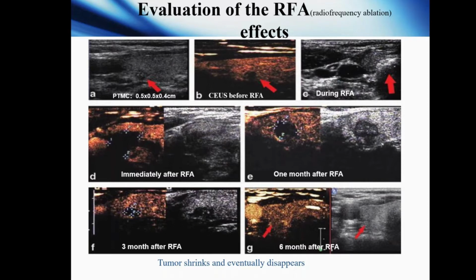This tumor is micropapillary carcinoma confirmed by biopsy. The tumor's maximal diameter is 5 millimeter, with several microcalcifications here. Very small lesion.